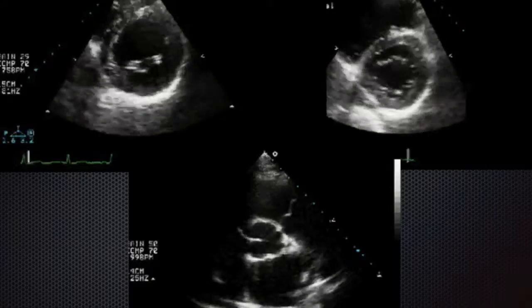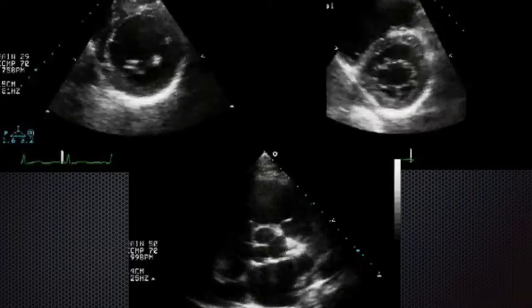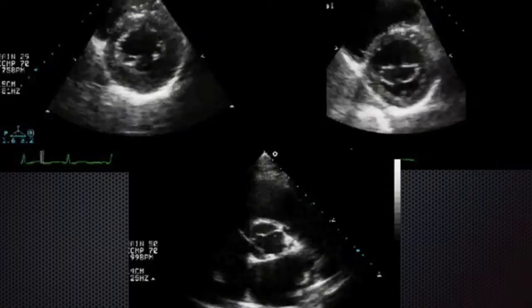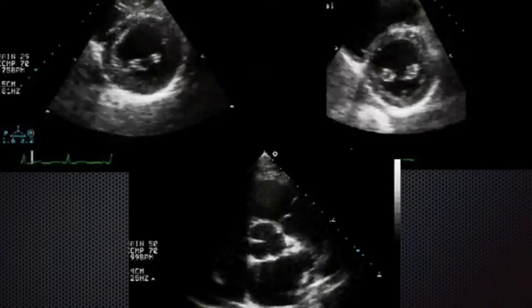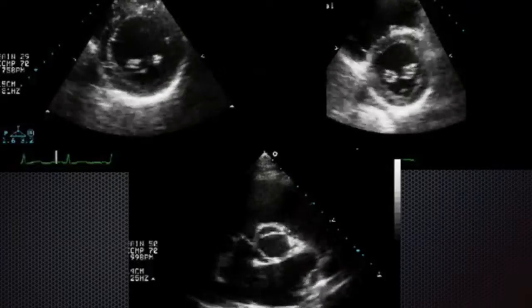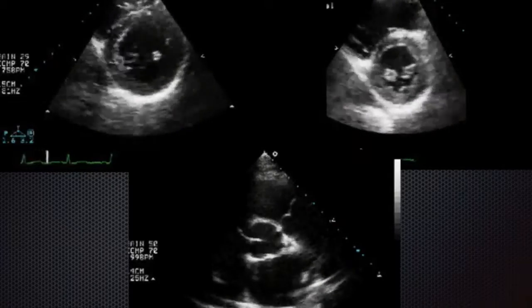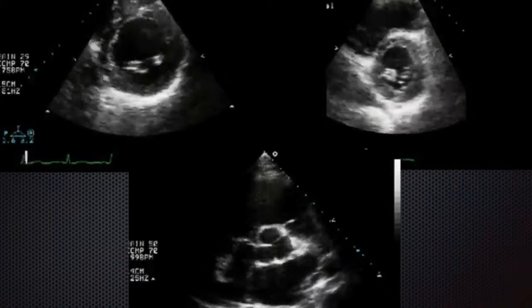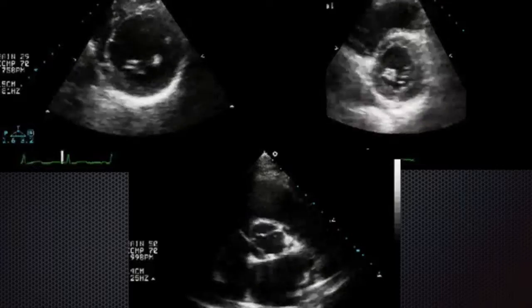Then to the left of the aortic valve on this view, you can see there's a valve opening which is tricuspid, and then above the aortic valve is the right ventricle, and then about 2 o'clock position on the aortic valve is another valve opening which is a pulmonary valve, and that obviously goes to the pulmonary artery into the lungs.